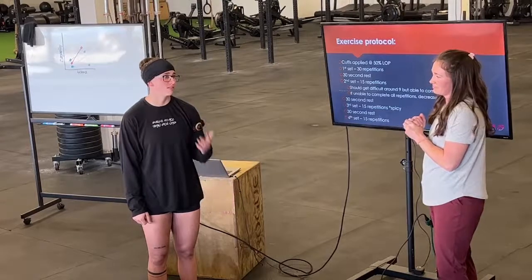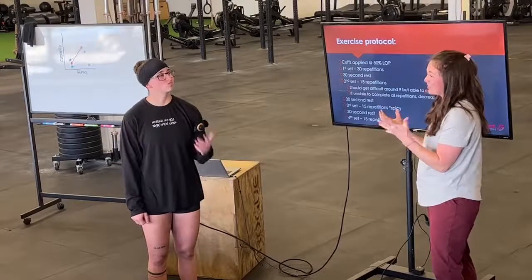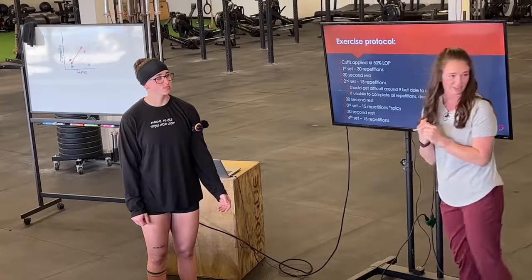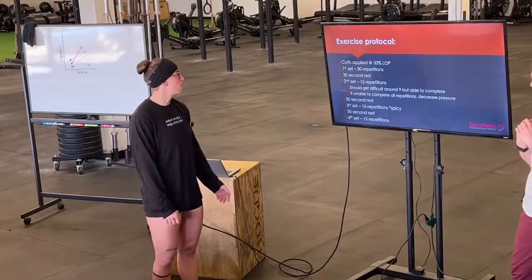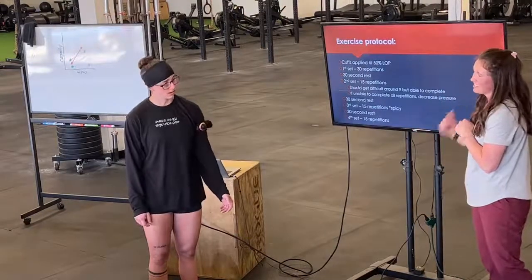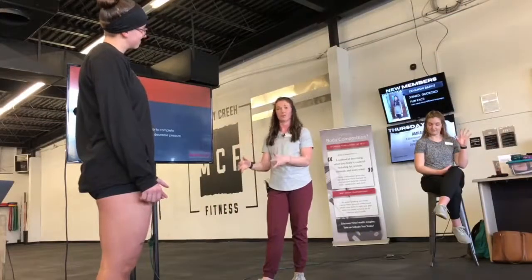Feel okay? Do you feel some burning? Okay. It is crazy. You wouldn't think that it's doing anything, but it is very challenging. So, okay, if she's counting to 30, we're going to work. Okay, well, perfect. And then, I guess I should mention this. If we get to a set and she's just like, I just can't go anymore, we're going to decrease the pressure, okay? But still try to keep the consistency in the load.